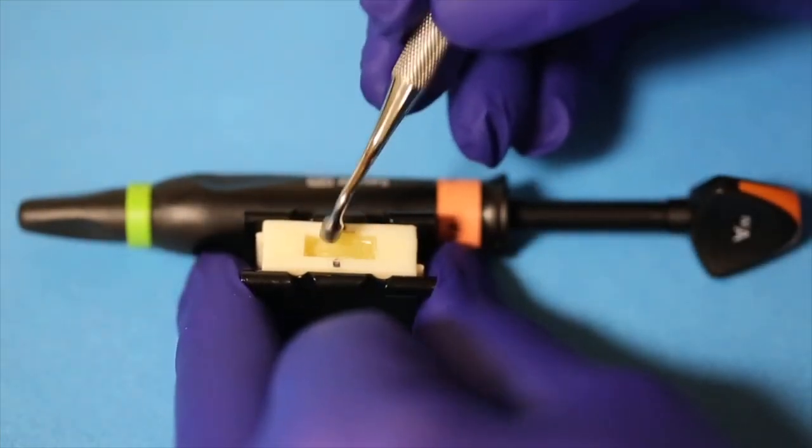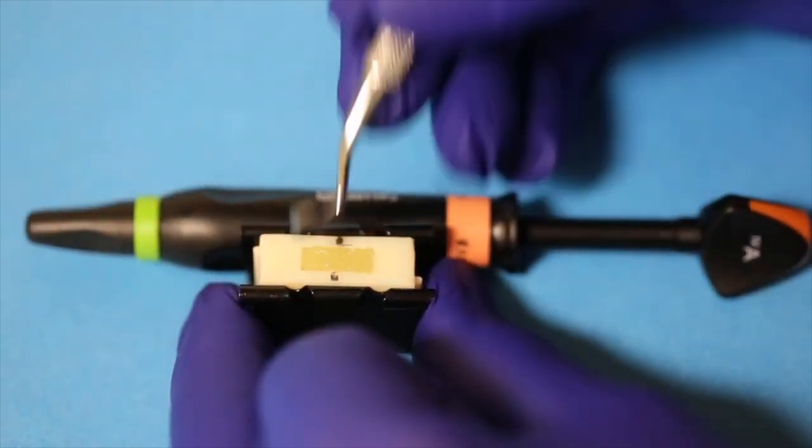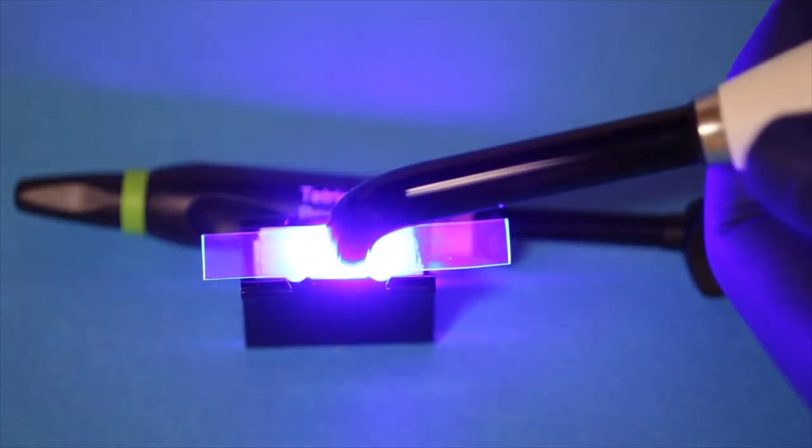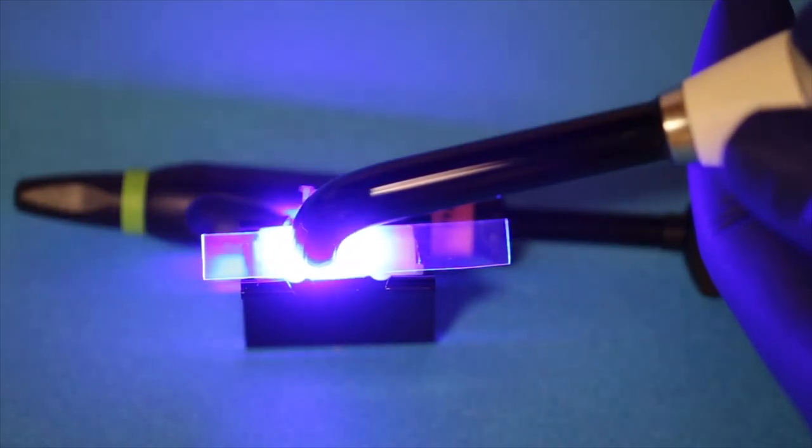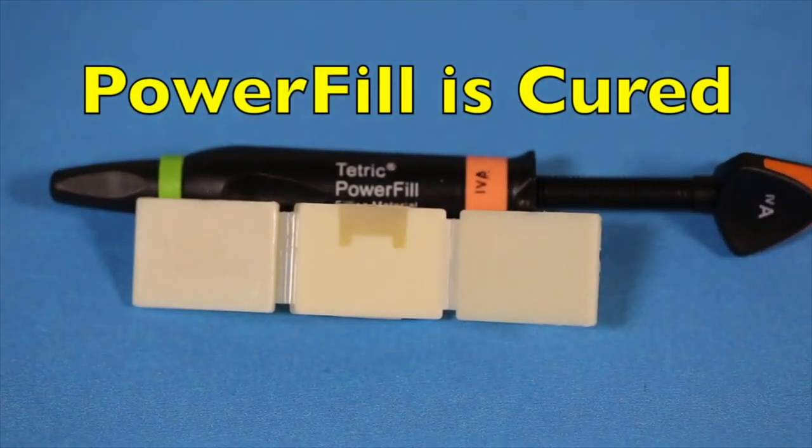Now what you'll see here is that I'm placing the material in bulk and I shall cure the material in bulk for 10 seconds over each of the proximal boxes to completely cover the composite. This is a much faster technique than placing the composite incrementally and light curing each increment.